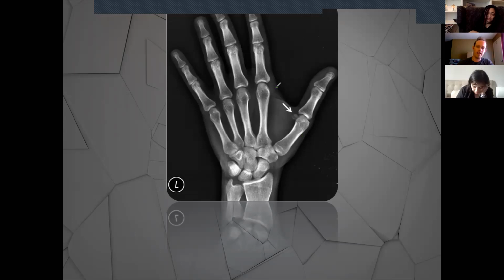But you'll sometimes see them right here. By the other metacarpals, you'll see them down here. You even see them up here by the joints of the fingers every once in a while. It's totally random. It's different between every person. So when you see those on x-rays, don't make that mistake of assuming, well, that person's got a fracture because the bones broke off. A lot of times what we're seeing is actually sesamoid bones within the hands and the feet. Very common mistake you'll see a lot of people make. Even technologists make that mistake.